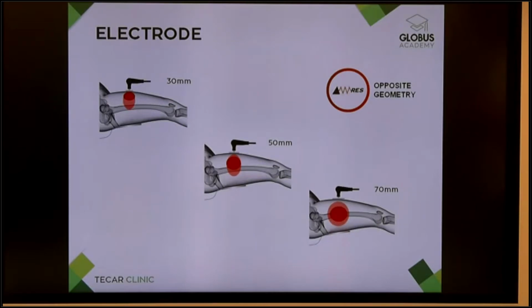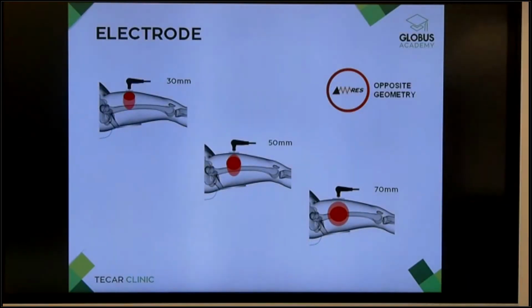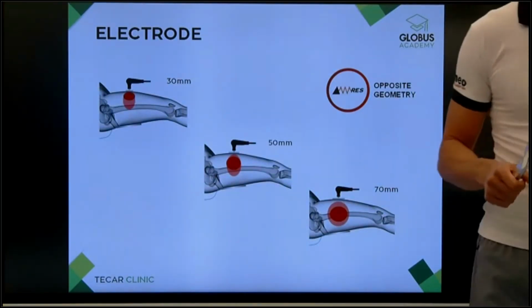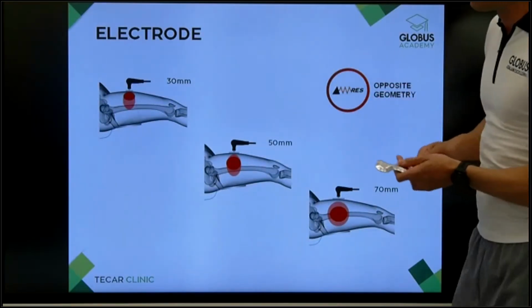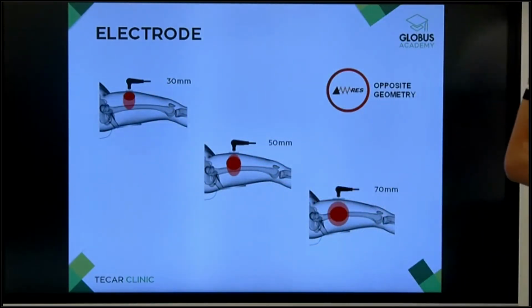Always in this case, we are going to treat dry tissues, those tissues that are poor in water, like tendons, ligaments, bones, and aponeurosis. And with the fascia tool, we are going to use mostly the resistive modality, because as you know, the tools are conductive. Yeah, good one. They are in metal, a special alloy material with a special treatment. So we are talking about the resistive modality, so depending on the surface that we are using, we can treat superficial or also deep tissues.